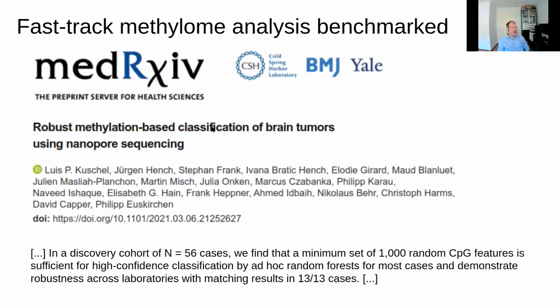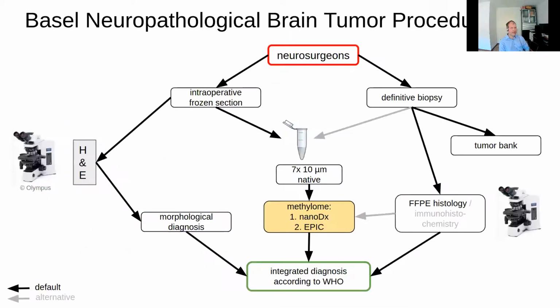It was also benchmarked, the method, in a multi-center approach. Now an ongoing European-wide validation study has been initiated by Philipp Euskirchen. And so far, we don't really see discrepancy. So we have already integrated it as an in-house validated diagnostic test in our repertoire.